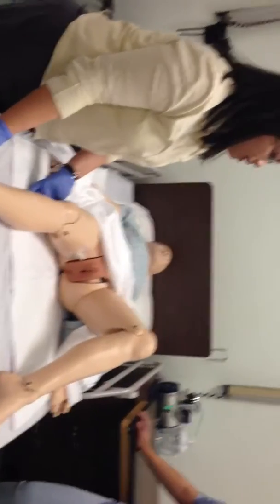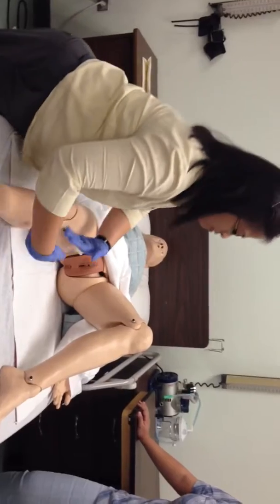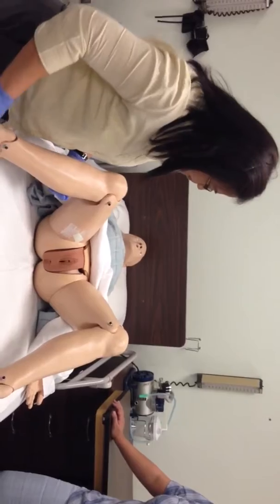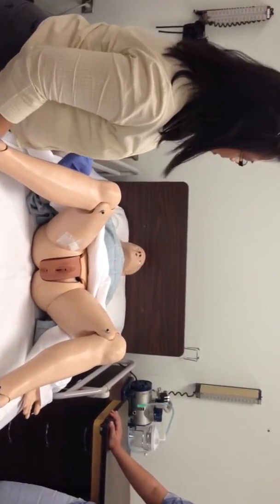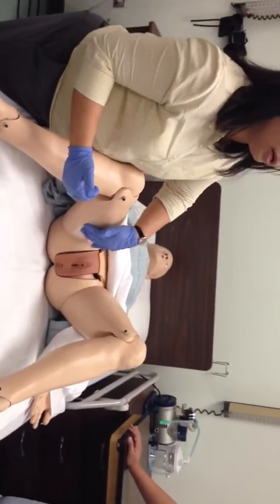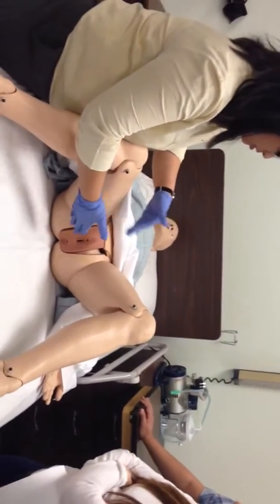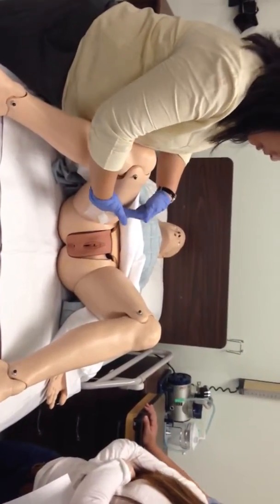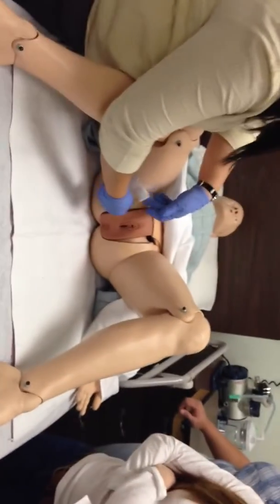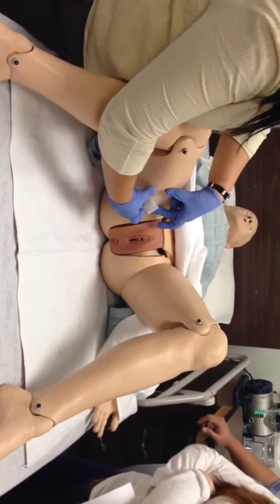This is lithotomy. You put up the leg away from you first because if you do this first, you're gonna go over it and it's not very convenient, okay? So you go like that and then you put the securing device. Or some people, they call this butterfly, but we just call this the securing device. All right? Not too close. This is too close, all right? You have to put a little bit of an inch or two over here. Okay. This is too close.